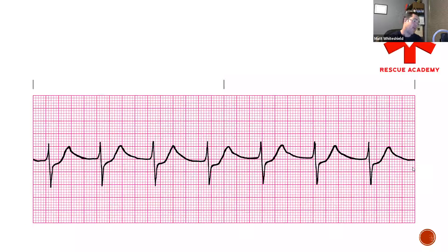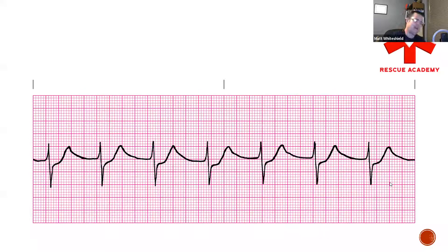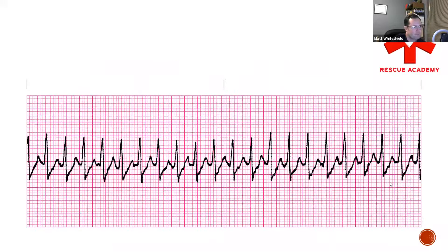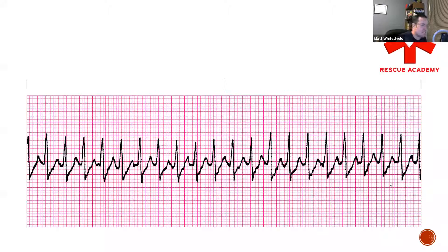We have one here: rate of 70, no P-waves — accelerated junctional, pretty straightforward. Next strip: can we tell if it's P-waves or T-waves? No, we can't. So we know this is SVT.